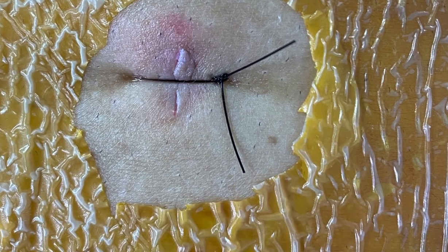Thank you. Small stitch — patient goes home. Thank you.